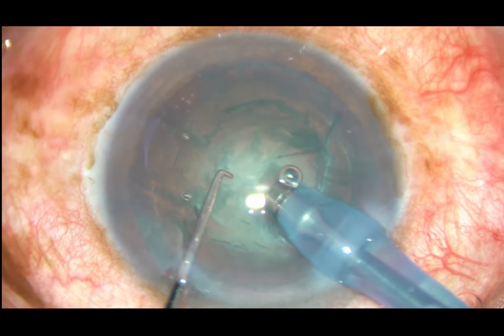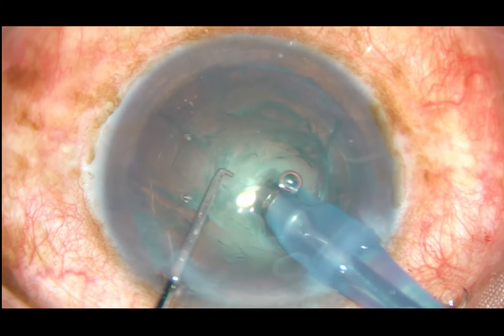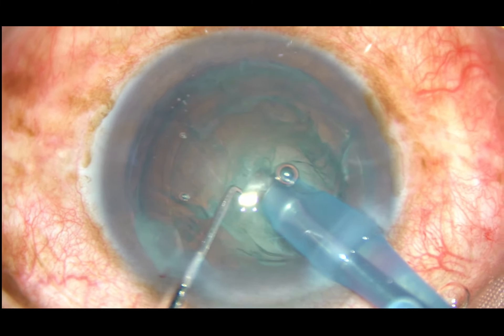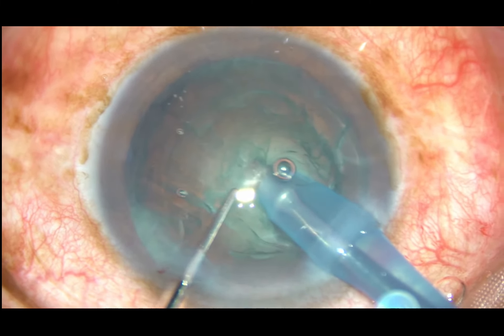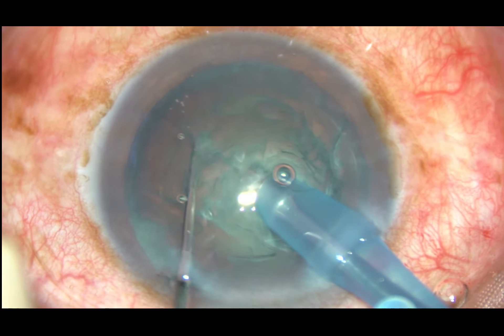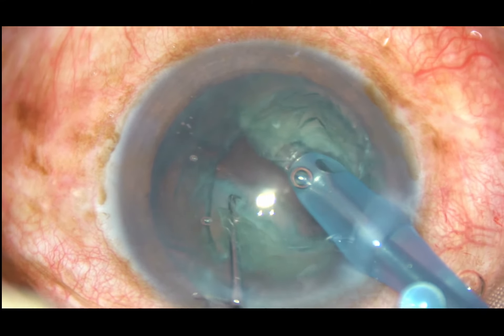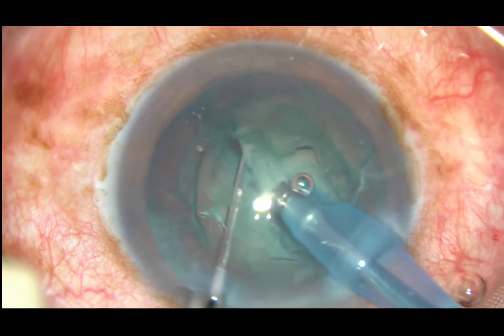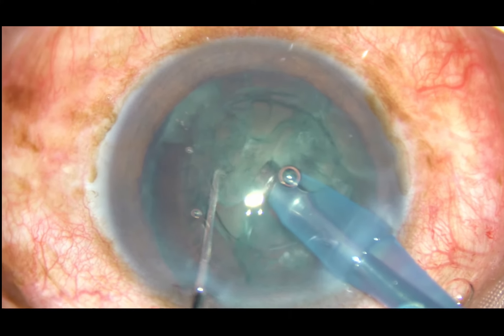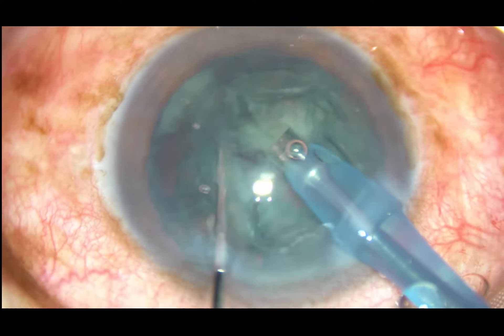You go to phaco-on mode, be at a deeper level, go to position 3 of the foot switch, apply some energy and immediately come back to position 2 — that is aspiration mode. Hold this mass very nicely, then chop it, bringing the chopper from periphery up to the phaco tip and separate. This is a slow demonstration of direct chop and after watching this, you will be able to do it.